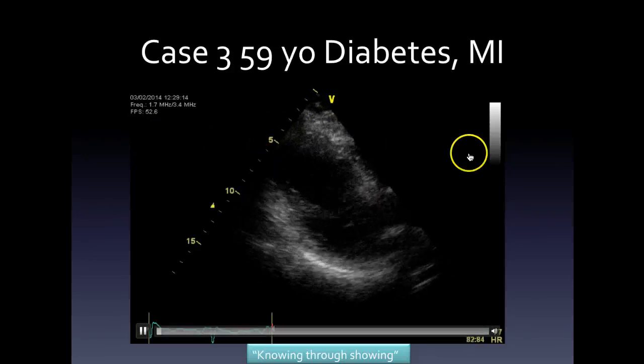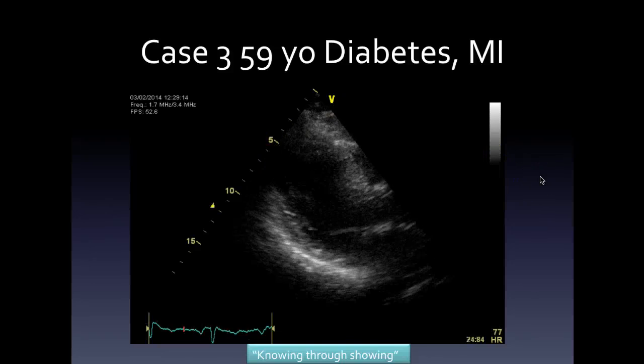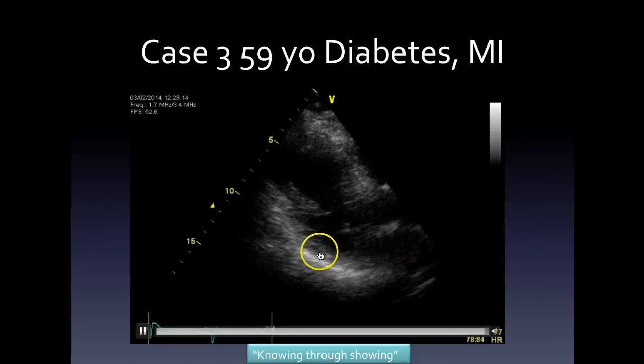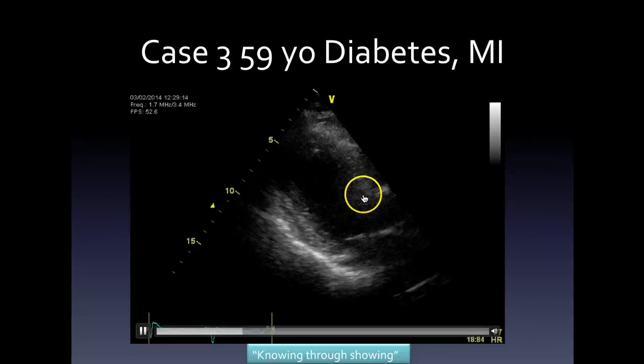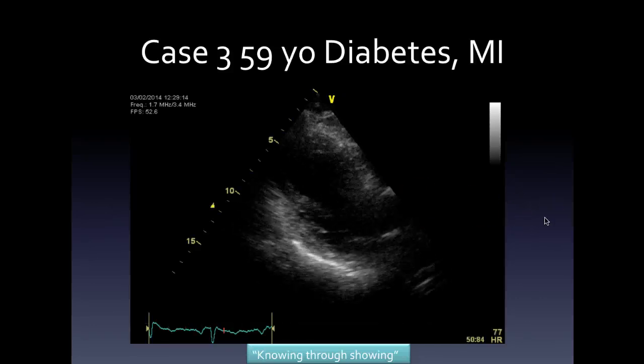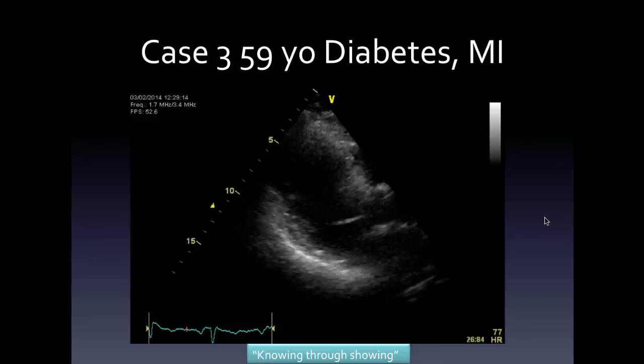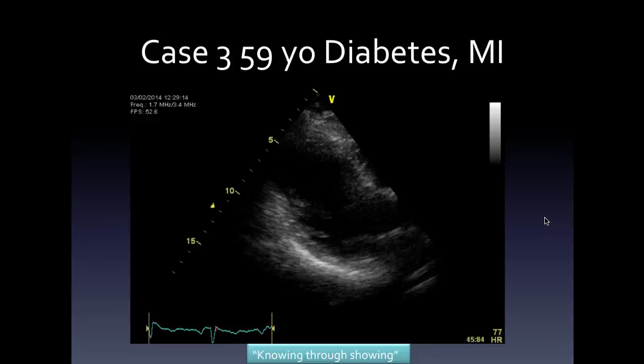But if you look at this fractional shortening here, in this view, this is vigorous contractility, which of course is exactly what happens. If you've got a regional wall function abnormality, the other portions will all bail in there to give a hand. So in fact, what you get is hypercontractility in the non-infarcted area.